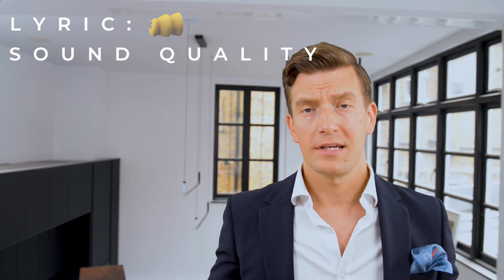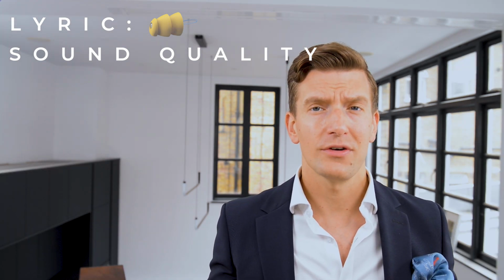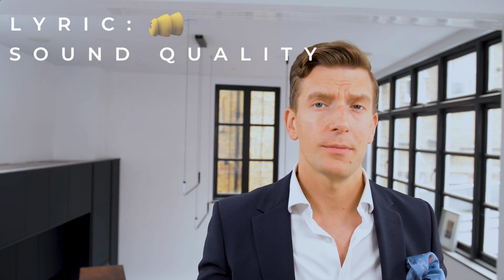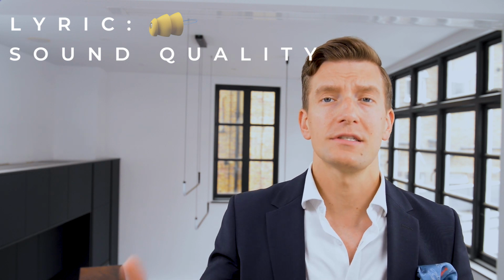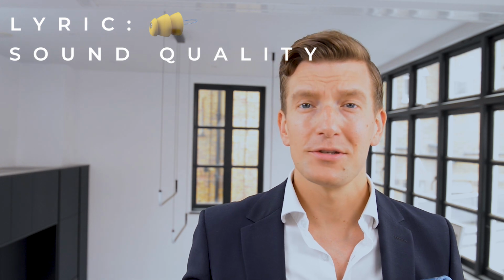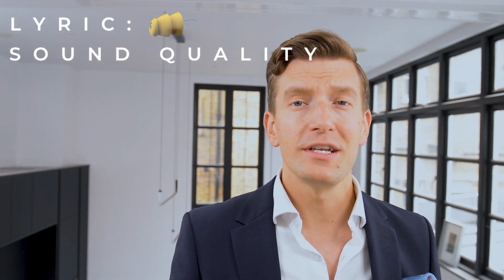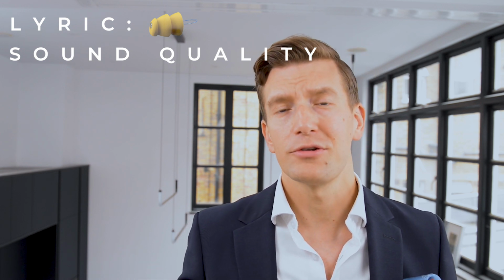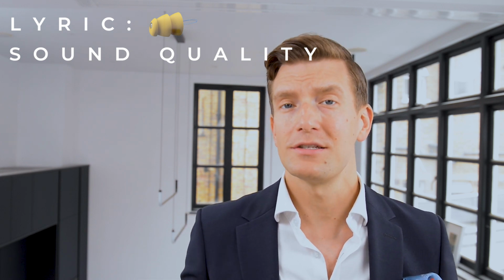To counter that, because this is an analog device, I don't necessarily have the same degree of parameters to be able to adjust when I'm adjusting a Lyric to match the set of hearing test results that I would do with a traditional set of hearing aids. So there's sometimes a little bit of trade-offs from a convenience and a discretion point of view with being able to hear it more effectively in groups and crowds and noisy situations.